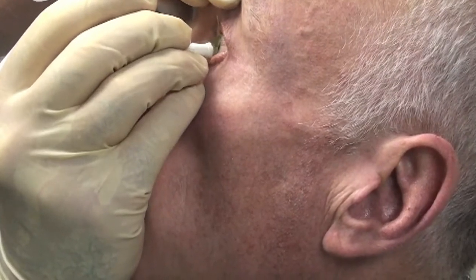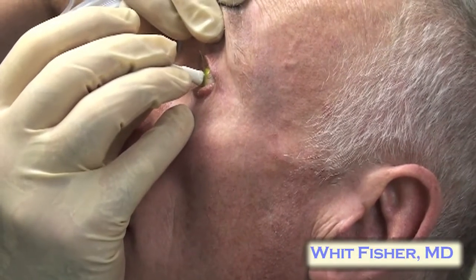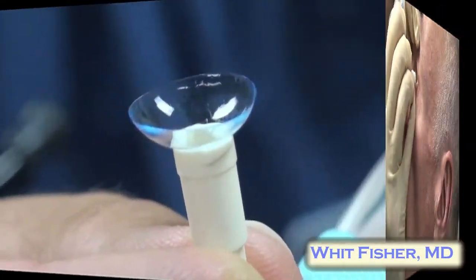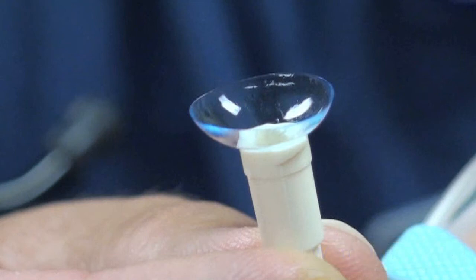Then gently apply that end of the butterfly tubing to the surface of the hard contact lens. Once you get a good seal, just lift it off. You may have to try once or twice, but it usually works great.